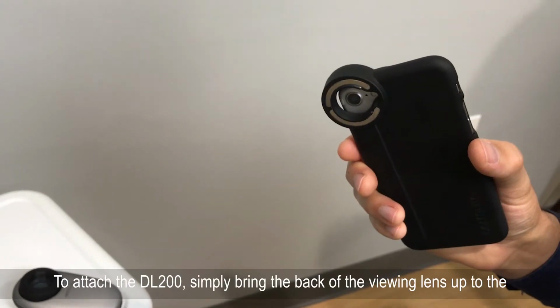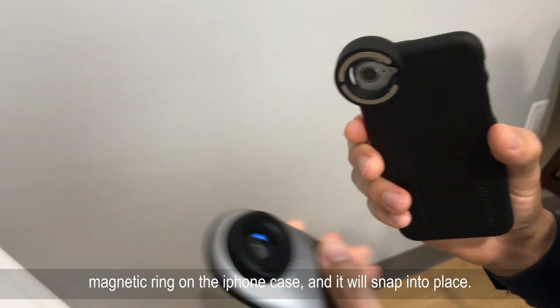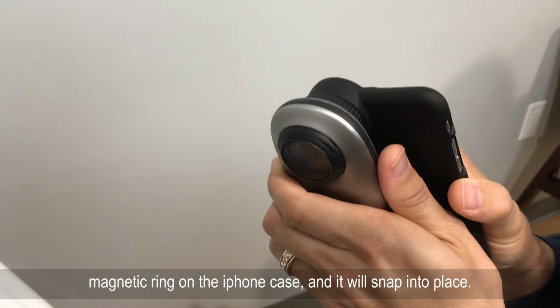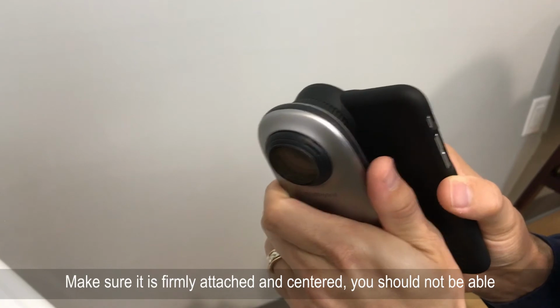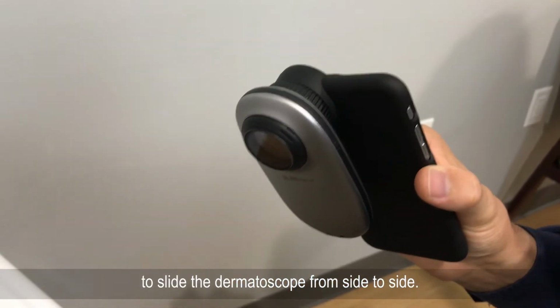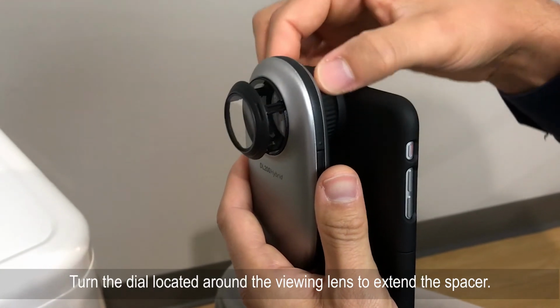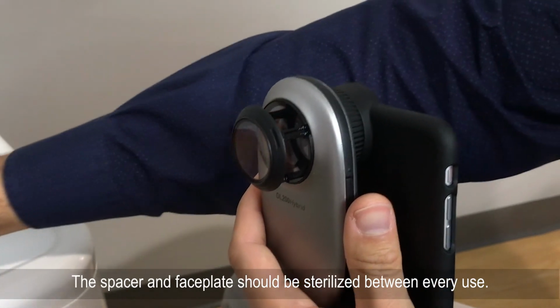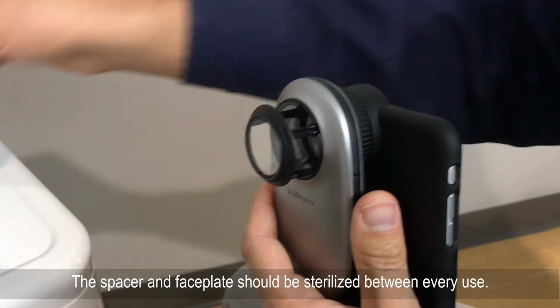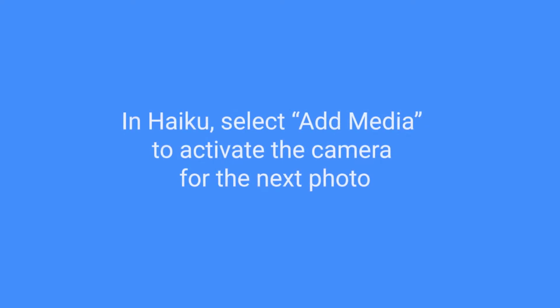To attach the DL200, simply bring the back of the viewing lens up to the magnetic ring on the iPhone case, and it will snap into place. Make sure it is firmly attached and centered. You should not be able to slide the dermatoscope from side to side. Turn the dial located around the viewing lens to extend the spacer. The spacer and faceplate should be sterilized between every use. In Haiku, select Add Media to activate the camera for the next photo.